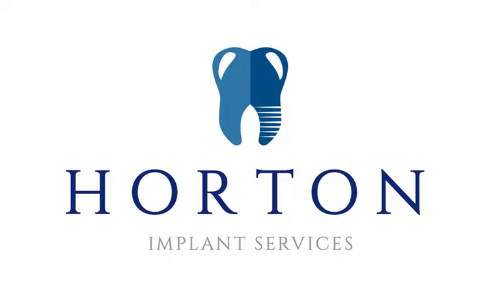So taking an x-ray as soon as the crown has been placed may give us a slightly inaccurate reading if we take an x-ray a couple of years later and then determine there's some bone loss that actually may have occurred once the implant had been in function for a month or so. So we often take that repeat radiograph maybe 2 or 3 months after the crown has been fitted and has been used by the patient, or bridge, or whatever situation we've put our patients into. So I hope that gives some insight into what's happening with the bone. Implants aren't a lifetime guarantee, although they are a very, very long-term successful solution for missing teeth.